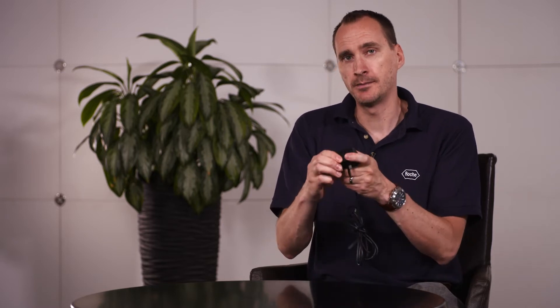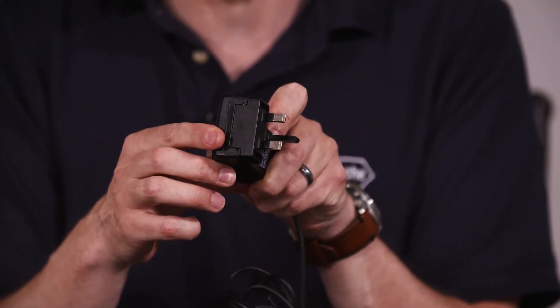When connecting the UK power adapter to the power supply unit, please press firmly making sure it's flush with the end of the power supply unit.